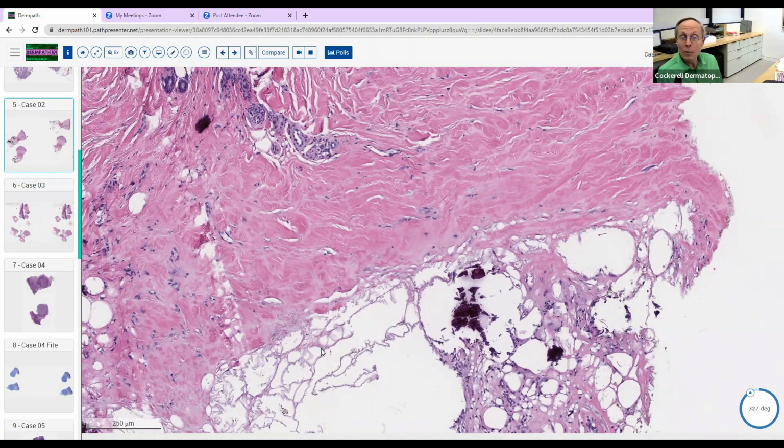We've got sclerosis, we've got fat degeneration, and we've got dystrophic calcification. And then we have some things that we don't see, that is, the vascular thrombosis and things like that we might want to look for in calciphylaxis. But the sclerosis is an important point here, I think. So when you see sclerosis, you should be thinking in terms of, well, what diseases give you sclerotic collagen? And there's not a ton of them. There's not like 100. There's probably only about 8 to 10.